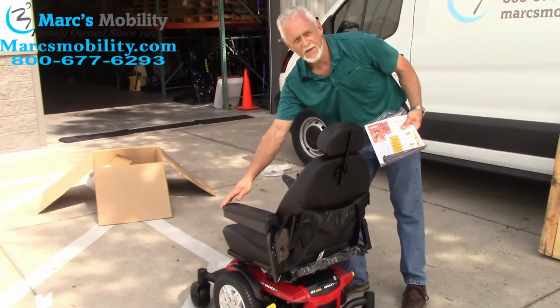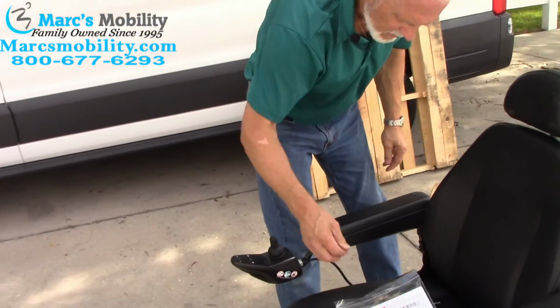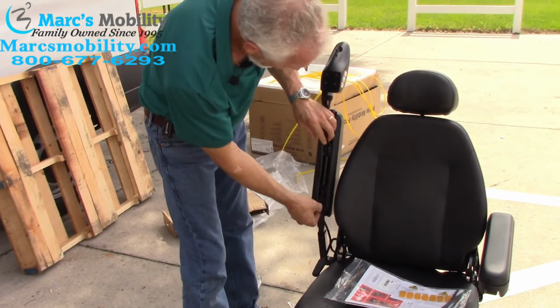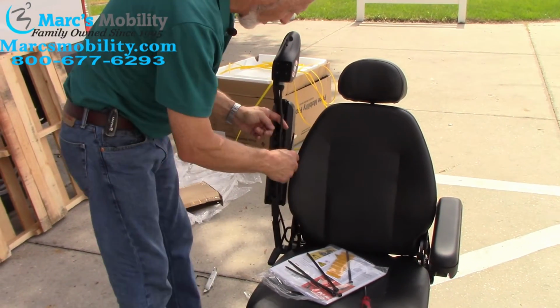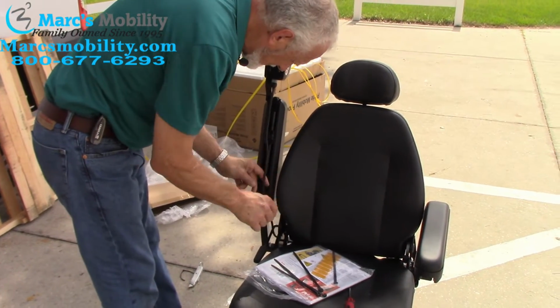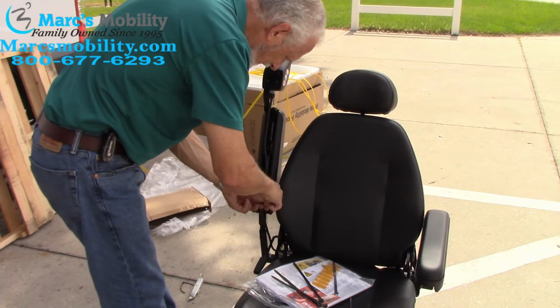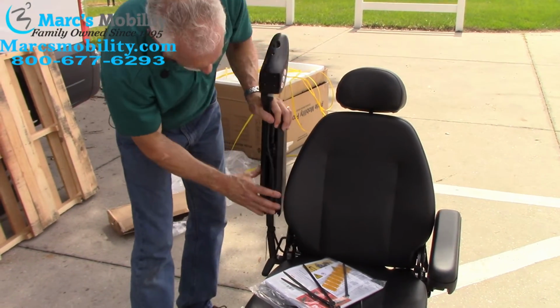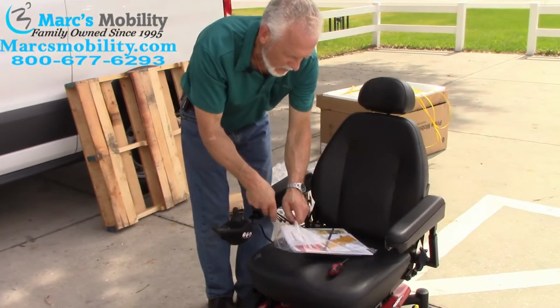You're also gonna tie it down. So you don't wanna tie it down too tight. You wanna leave some, you wanna tie it down here first. So you want to do this one first. Just tie it under the arm, make sure you have enough of it, and then tie it towards the back. And that's it, folks.